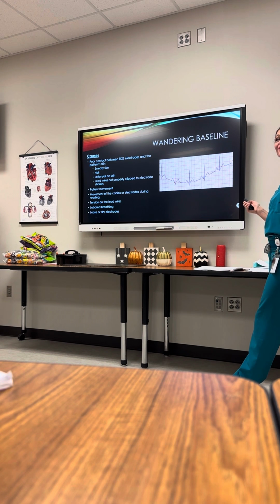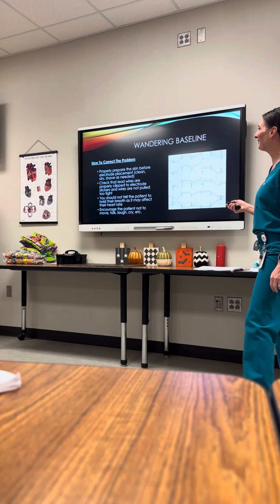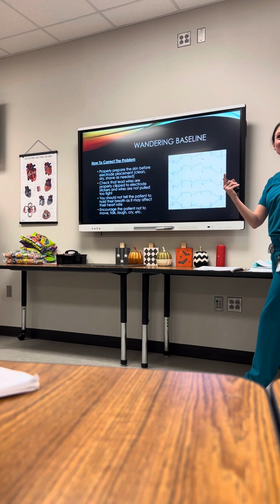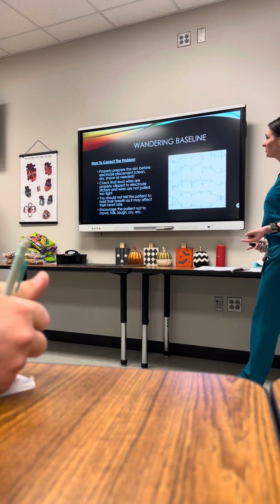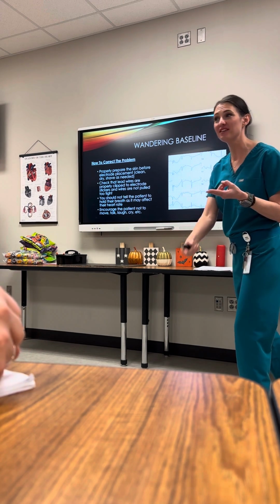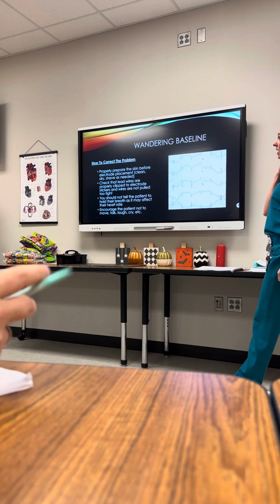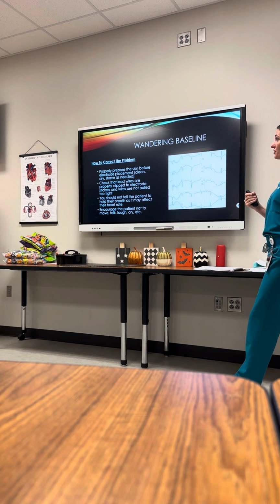And we need to know how to fix them. So that's the next slide when we're ready. Are we ready? How do we correct the problem? We are going to properly prepare the skin, which we just talked about. Maybe use the alcohol swab, shave the patient's hair if you need to. Check that the lead wires are properly clipped to the electrode stickers and that wires are not pulled too tight.